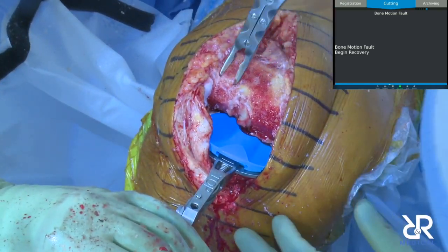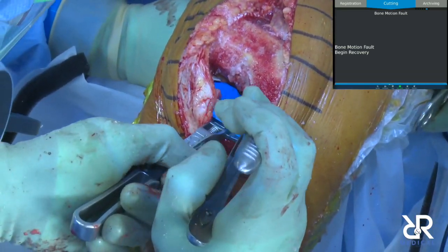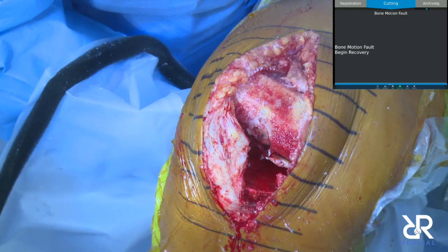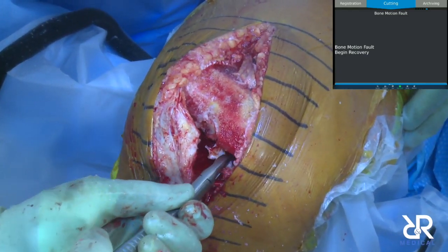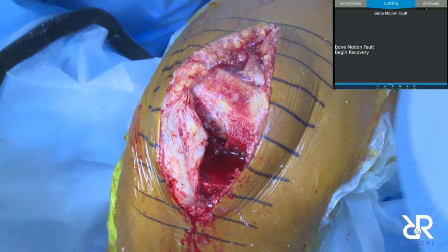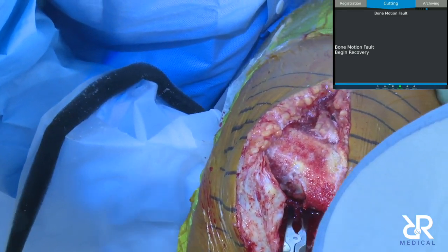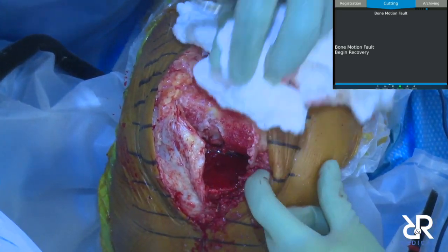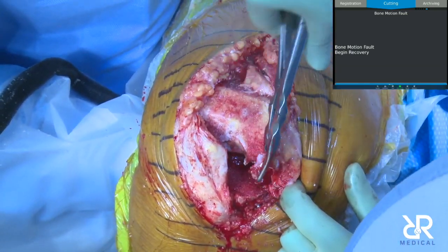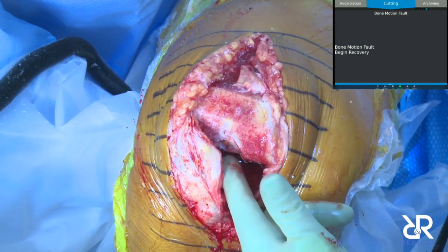Lift up. Let me have a one size smaller tibia with a one size smaller poly. That's a one. This is a two. That nine won't work. Oh, I see. That's a two and a nine. I just changed that to a two so you have the nine poly. Okay. This was a one tibia.